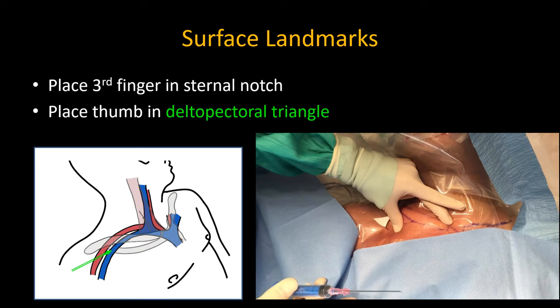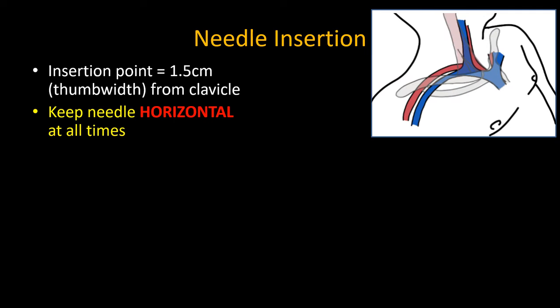I place the middle finger of my non-dominant hand in the sternal notch, which is my aiming point, and my thumb in the deltopectoral triangle. The introducer needle is inserted here, literally a thumb width away from the clavicle. The key to avoiding pneumothorax is to never point the needle downwards — this is the main pitfall with many techniques described elsewhere, which describe things like walking down off the clavicle.